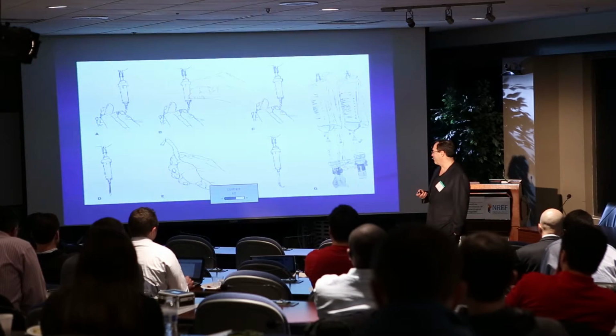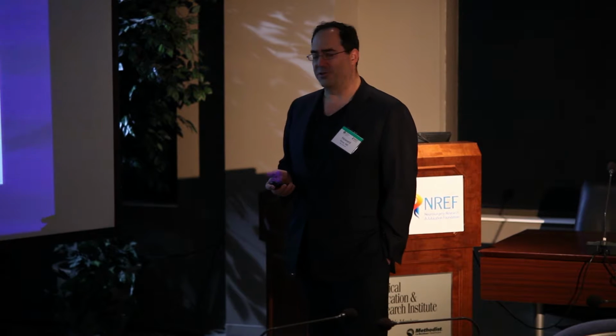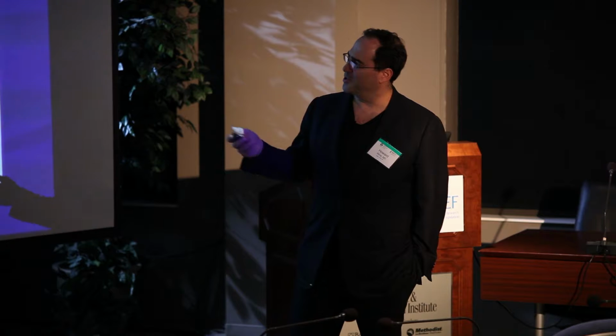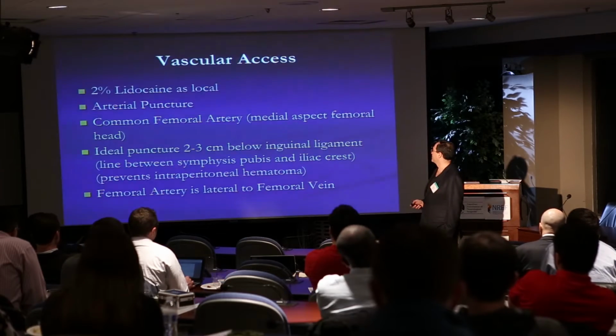At the beginning of every year, just like when the turnover of residents and nurses come through for training, you have to be a little bit more vigilant looking for air in the line, because air is not your friend in this situation.